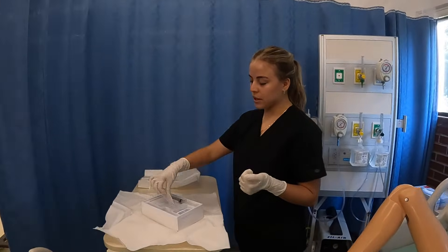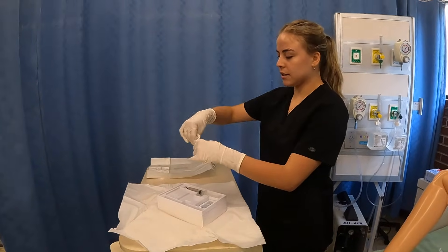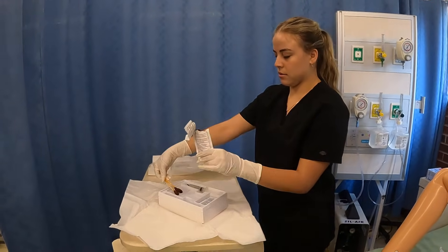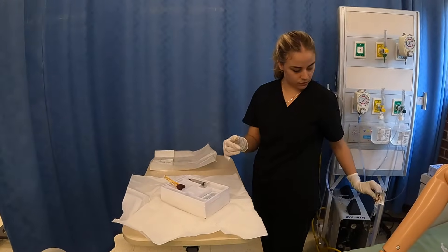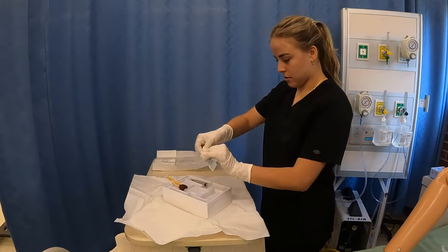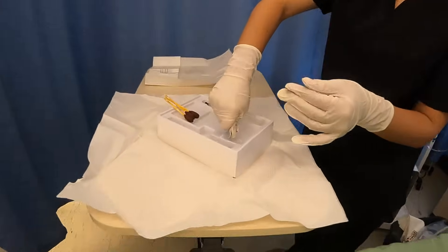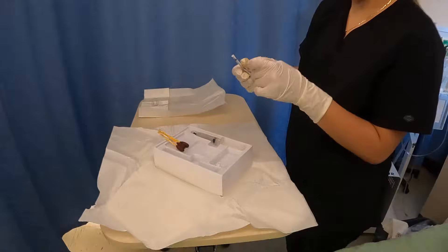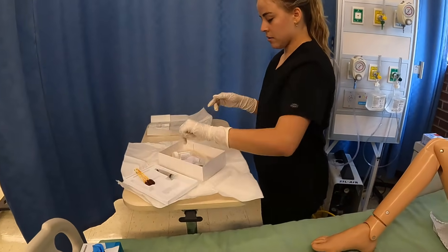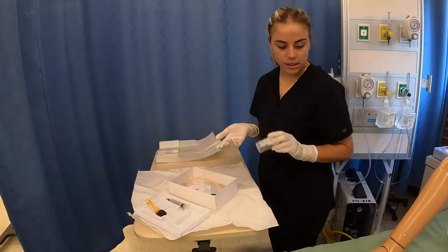After putting my sterile gloves on, I'm going to start prepping my supplies. We have the iodine, and I like to open it up and put all that out. And then I have my jelly — I'm going to squeeze it inside the container. Now after preparing all that, this container is for UA collection if you need it; I don't, so I'm just going to dispose of this.